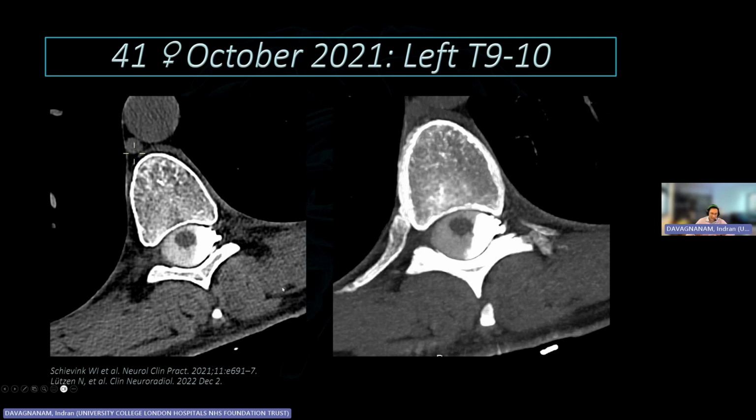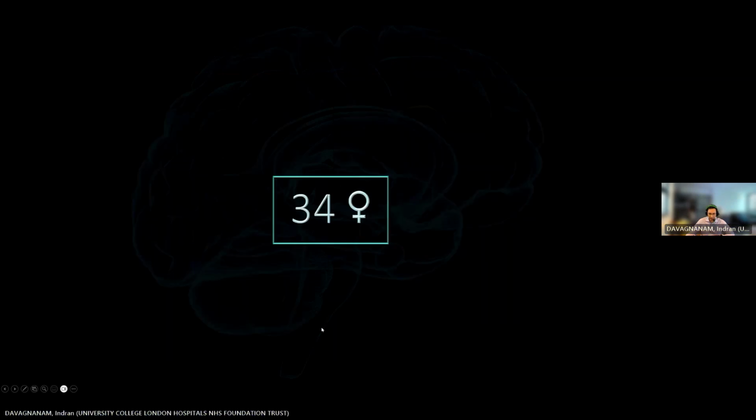And this is just to highlight that there may be more than one potential source of leak in some patients. So it's always worthwhile looking very, very hard and expecting the unexpected. So we've got some publications again from our colleagues in Cedars-Sinai and in Germany who have actually shown that.